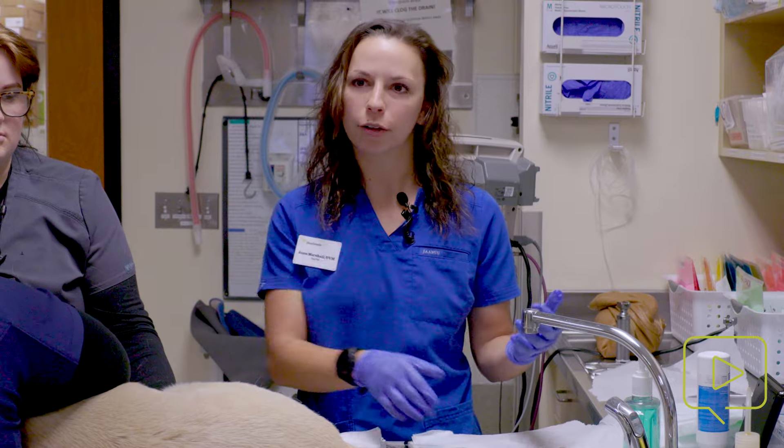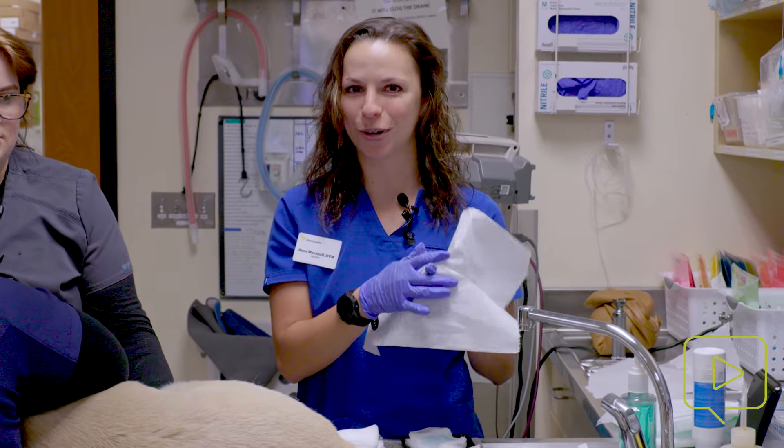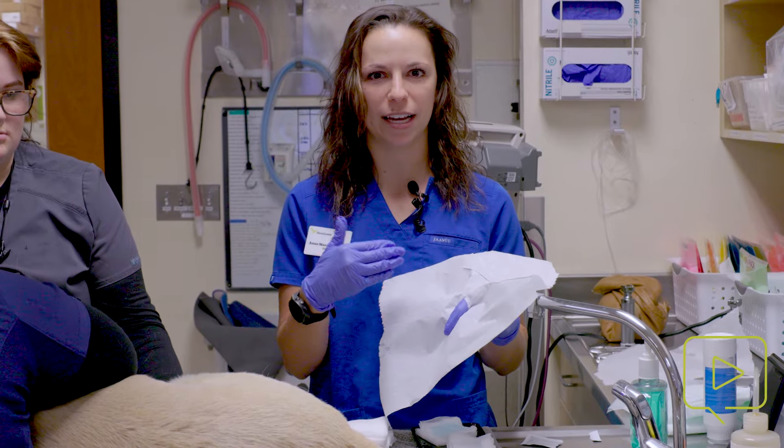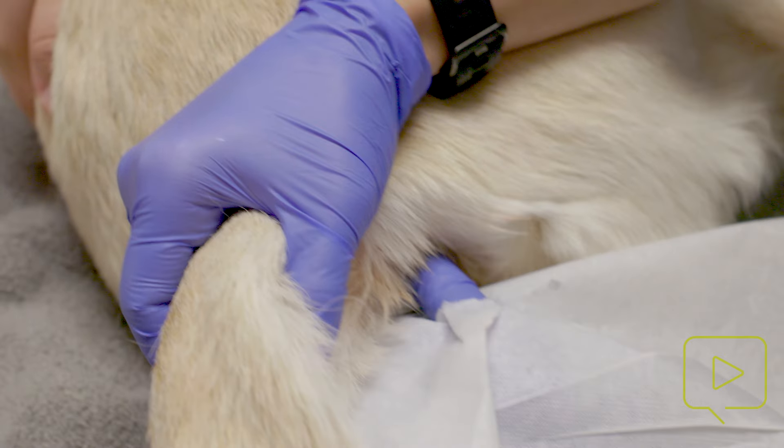Hi, my name is Dr. Ann Marshall and today we're doing an anal sac expression on a sedated patient. I have a trick I learned from another veterinarian — it's very cheesy, but I make a finger hole through a paper towel, and this helps protect me from the material that I squeeze out. I have applied sterile lubricant to my finger.